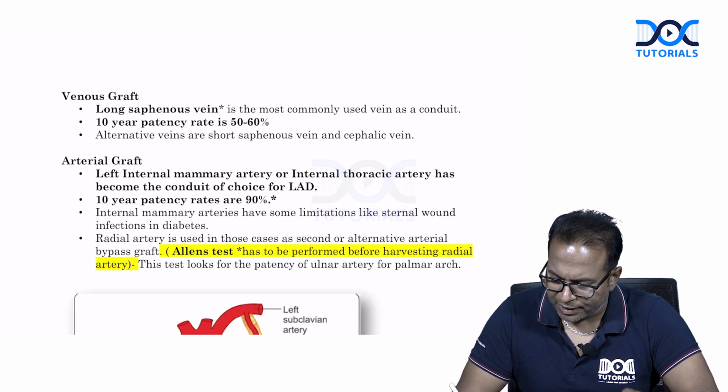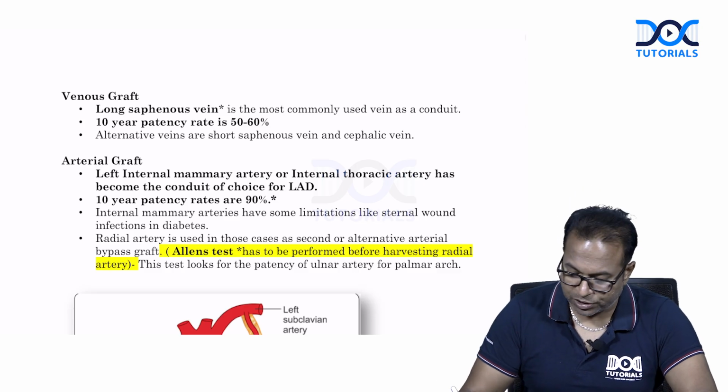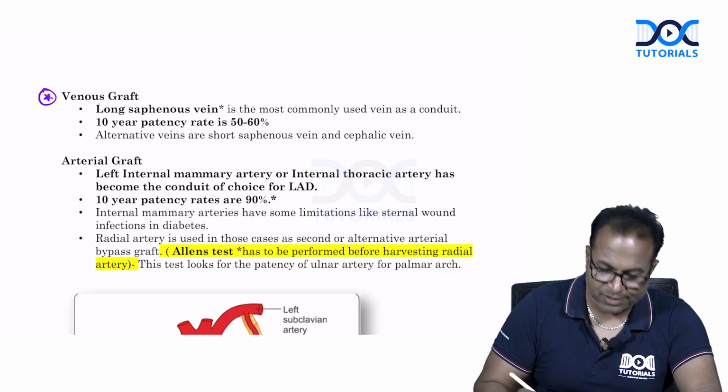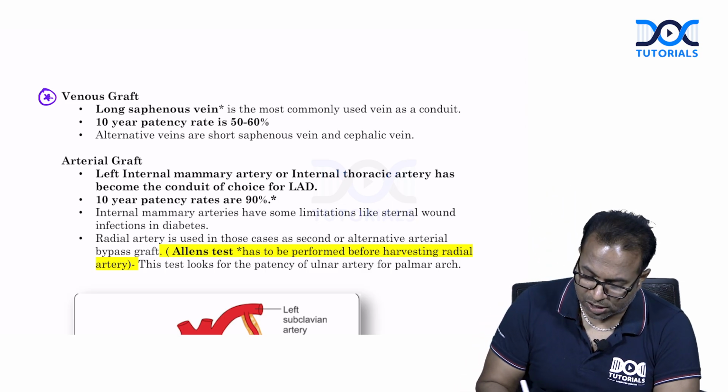The one important thing done by the cardiothoracic and vascular surgeons is doing a graft procedure. The first thing they will do, once the surgery has started, is that one surgeon will take a graft from the vein. They take the long saphenous vein.